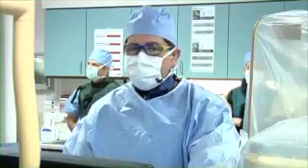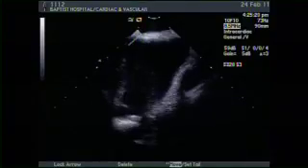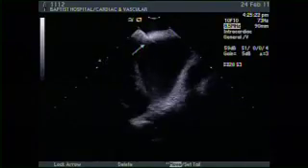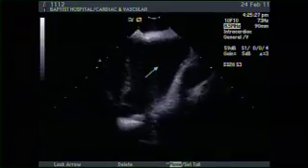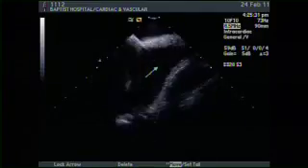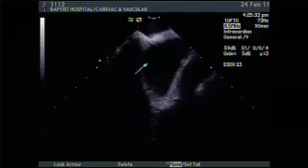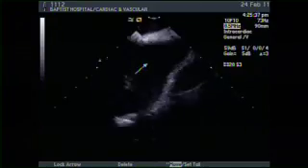So, okay, Ralph, please show the ICE image. Remember before, this was the left atrium, right atrium on top. Here's the catheter going through the PFO into the left side of the heart, and through that catheter, Dr. Quesada will deploy his device. Again, just keep your attention focused in the area where the arrow points.